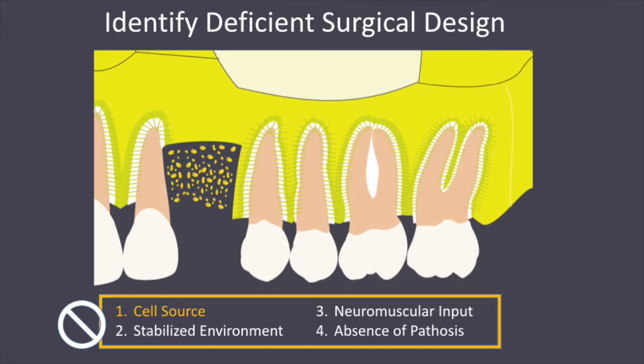However, this plan will not meet the criterion for a bone-forming construct because, number one, it cannot create a volume in which the center is stabilized. The defect is too big for the cells in the center to be in an environment that is stable enough to undergo morphogenesis and organization.